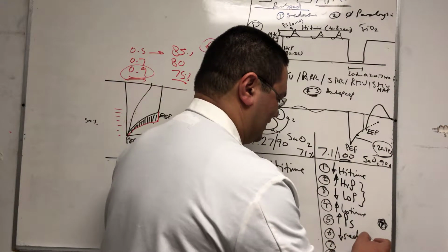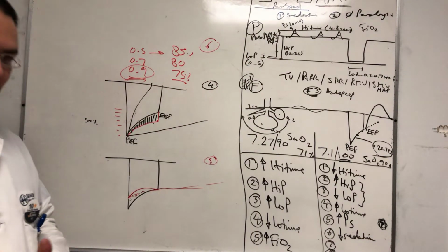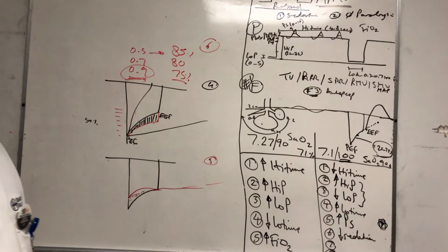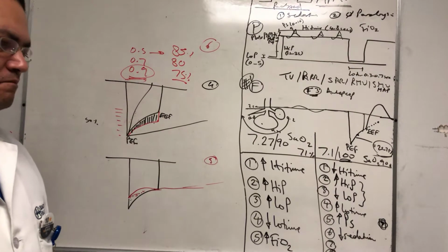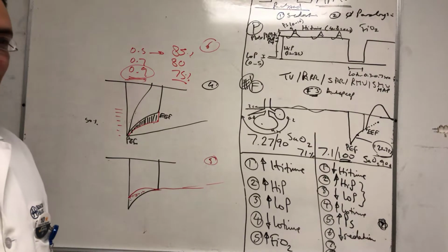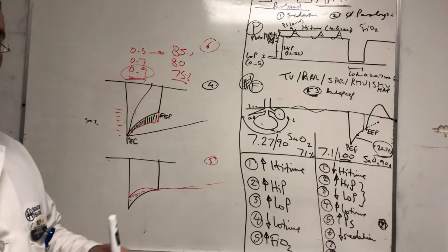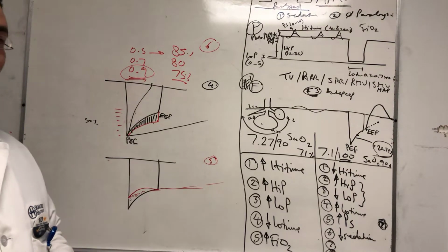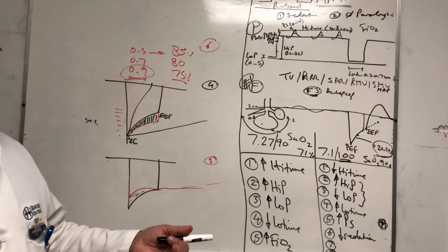Decrease sedation. With most of the other controlled modes of ventilation, you have the patient who is doing badly. What are you going to do? You're going to sedate the patient more. Still doing badly, you're going to paralyze the patient. You take over. Every time the patient does worse, you take over more. This mode of ventilation is the opposite.